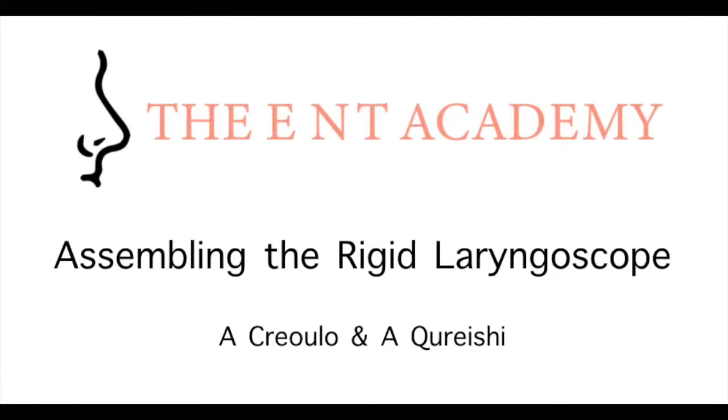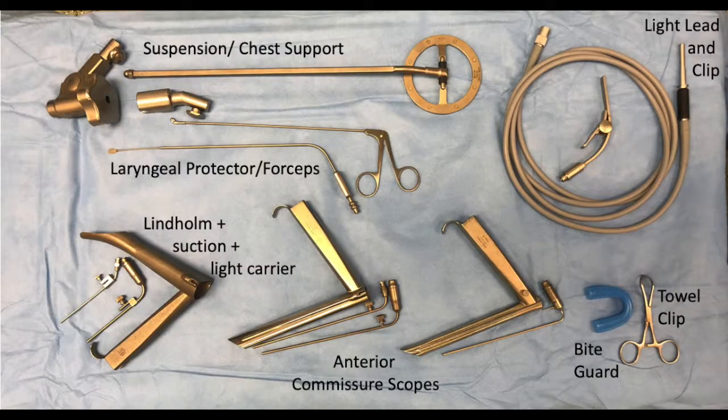Welcome to our instructional video on assembling the Rigid Laryngoscope. Our standard kit consists of the Lindholm scope, anterior commissure and Ruddert scope. We also have a chest support and laryngoscope holder, light lead, light clip, bite guard and towel clips. There are additional light carriers and suction ports.